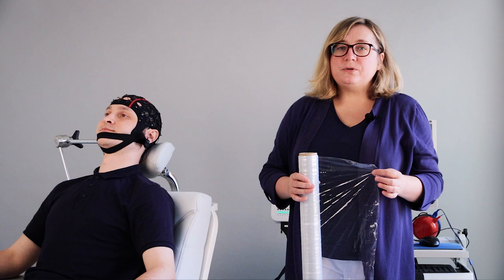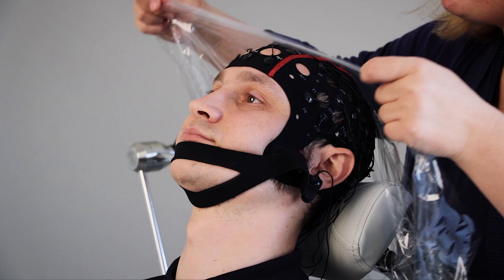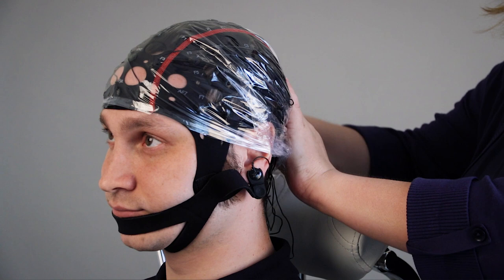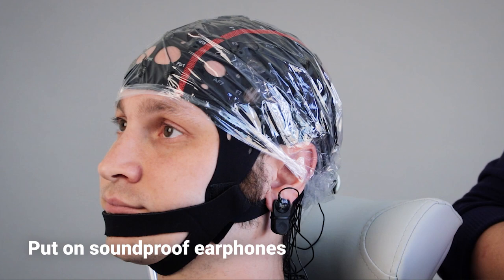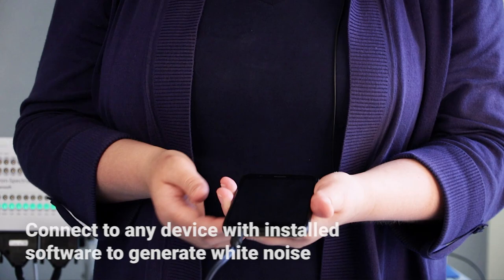I will use cellophane film to protect the coil from contamination by gel. I wrap the patient's head with film. I put on soundproof earphones and connect them to the cell phone.